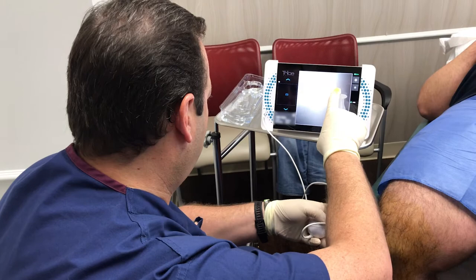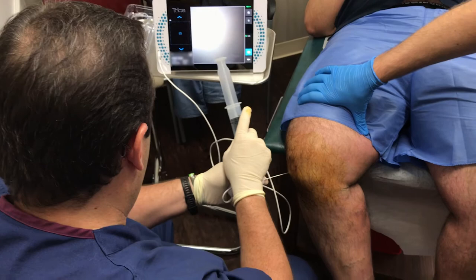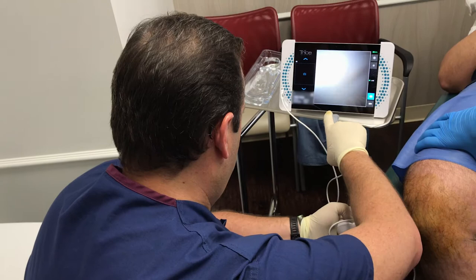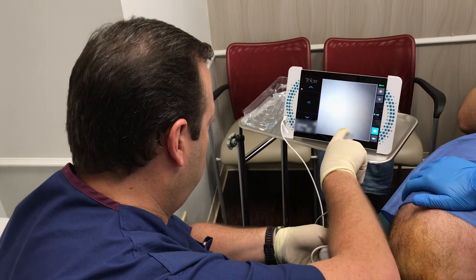So what's going to happen now is Rob's going to move your leg around a little bit to open up that space. Just a lot of pressure, like I said. Just try and let Rob move your leg around — the more you can relax, the better off you are. Rob didn't tell me I need to go do yoga before this.